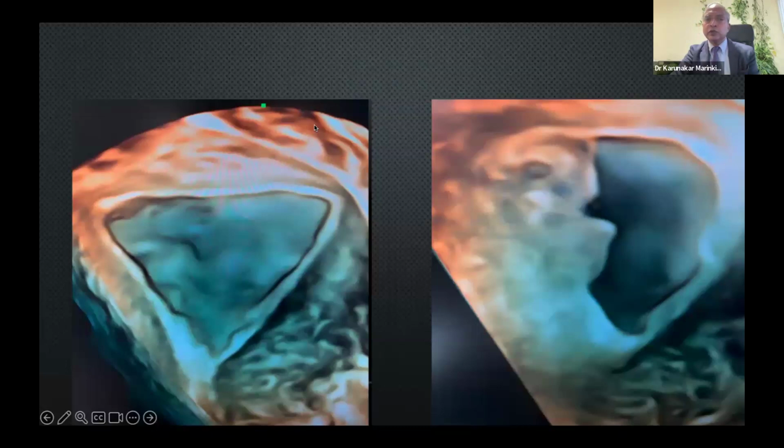So what do you do with focal endometrial hypertrophy? What do you do? By just shaving it off, it's possible the healthy endometrium might grow, or you might cause a permanent bald head because you used heat that damaged the endometrium and caused endometrial sclerosis. Then what will happen? At least you can put the embryo in the left quadrant by using a Cook catheter, directing the embryo to the left quadrant under ultrasound guidance. So that's called endometrial mapping. So for every slide I'm sharing with this ultrasound lecture, I'm giving you clinical relevance to it.